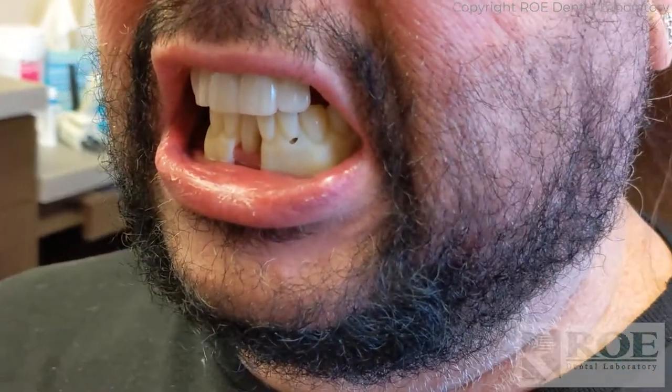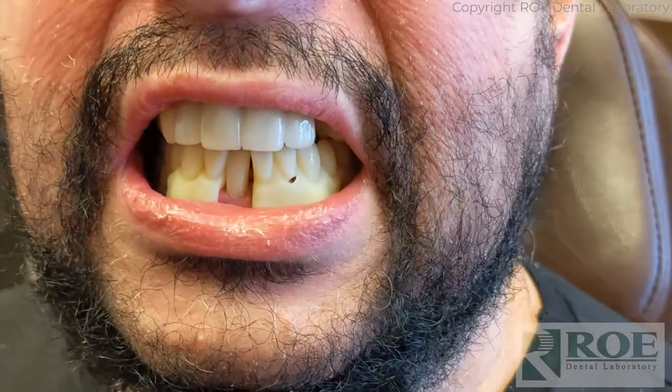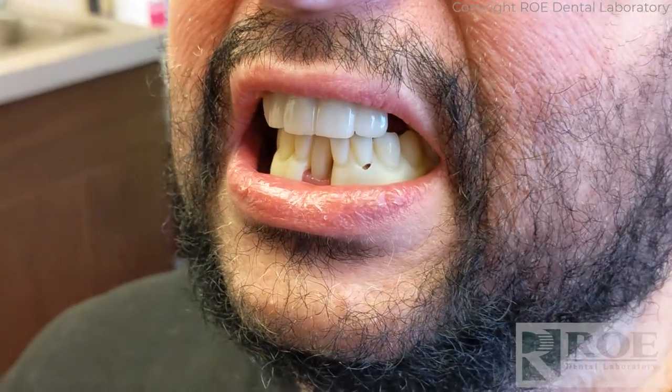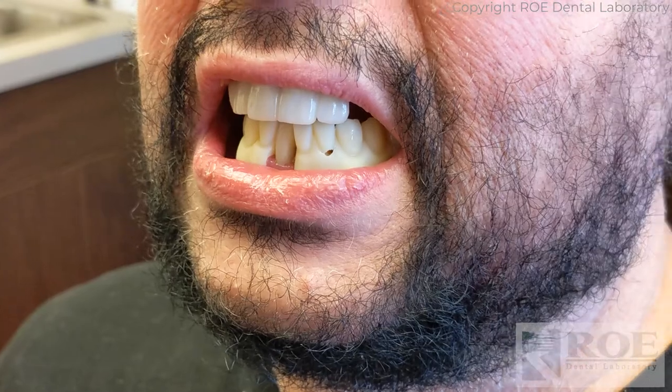So with these tried in, there's also a little bit of an aesthetic component to the try-in. We're making this from our try-in setup for dentures, so the midline, tooth shape, tooth size, and amount of exposure — that's also what we're looking for here.